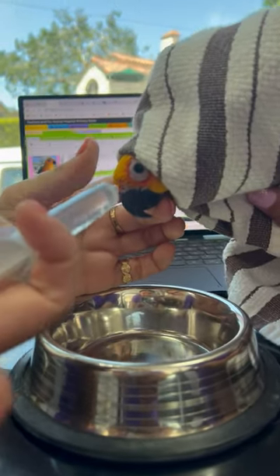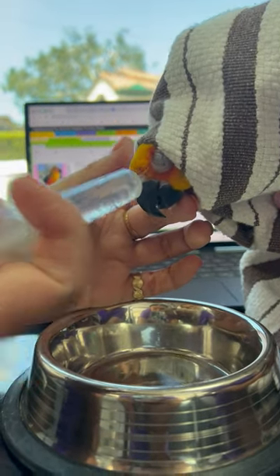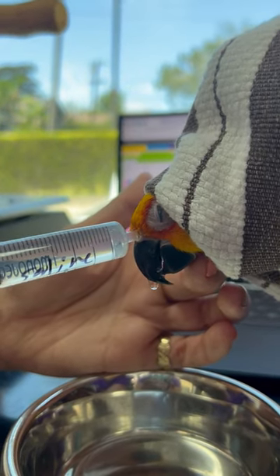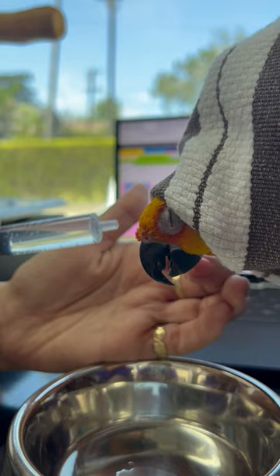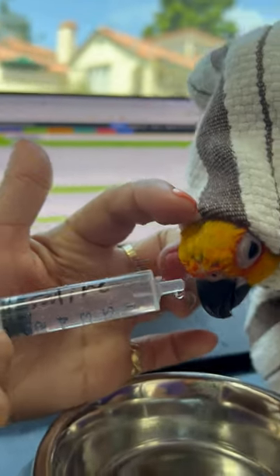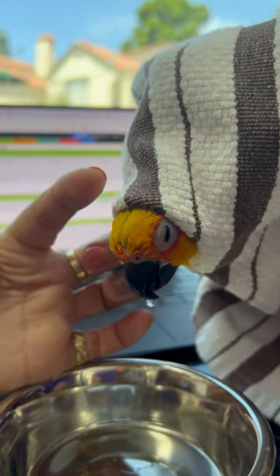A nasal flush means I'm flushing — and this is warm saline — I'm just flushing it in her nasal cavity, and it's coming out. Some of it's coming out of the choana in her mouth, some of it's coming out the other nostril. That's good — that means there's communication with the other nare. There's communication that way, that's good.